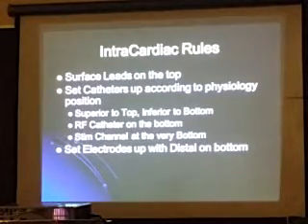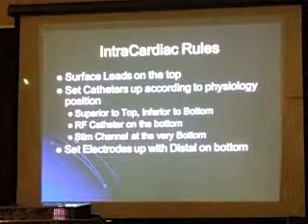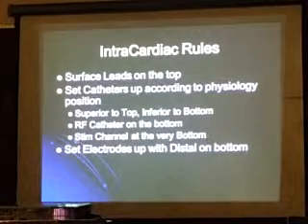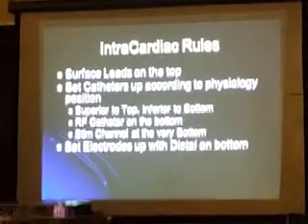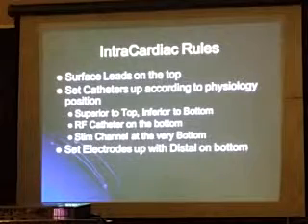Some things when you're creating your displays: your surface leads are always on the top, and then you can set up your catheters according to physiologic position from superior to inferior. So if I'm thinking about that, my high right atrial catheter is probably going to be on top. My RV is going to be on the bottom.